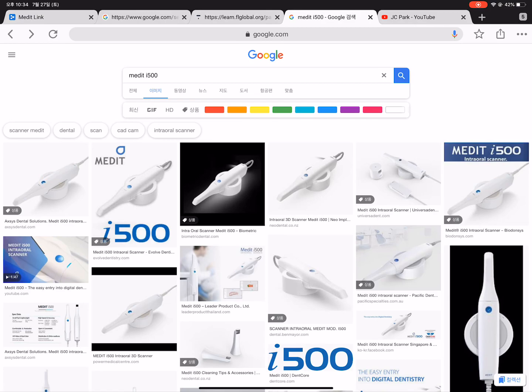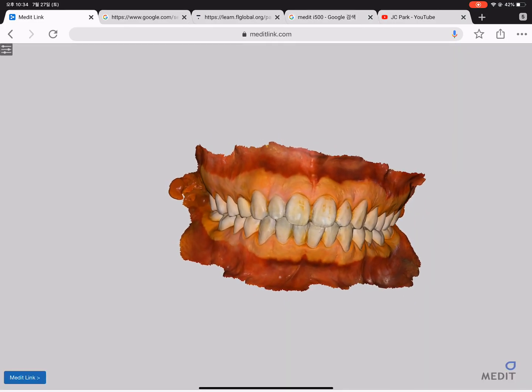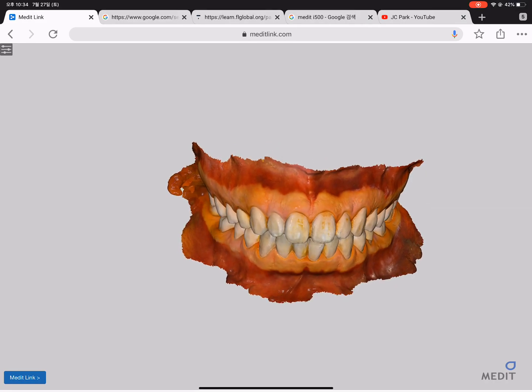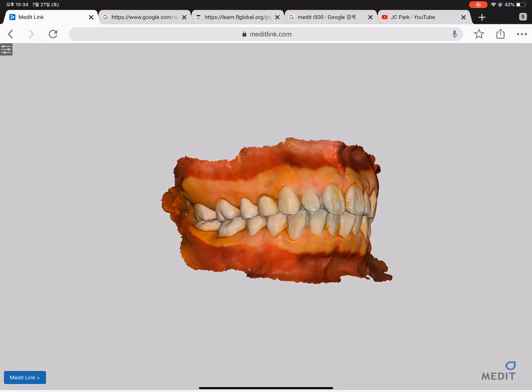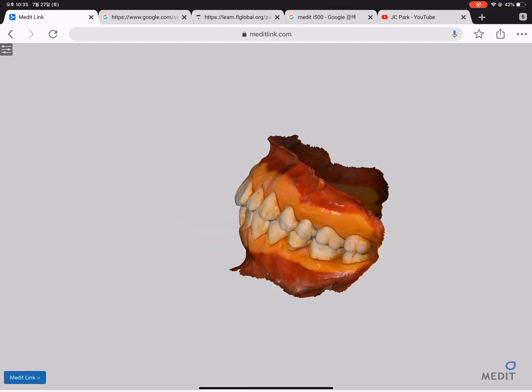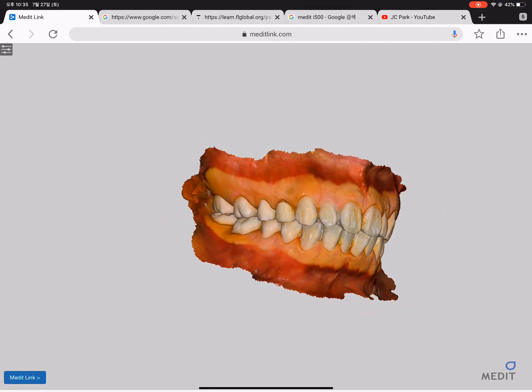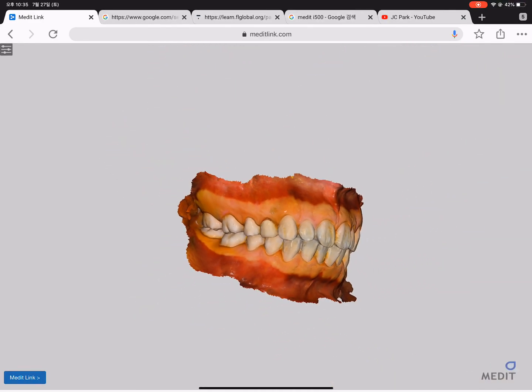You get an external link so that you can view the scan from a web browser. If you click the link, you will see exactly this picture. Without any installation of an application, you can go directly to this link. It is very lightweight and fast, so you can rotate the scanning and zoom in and zoom out. It's easy to share and easy to study after the scanning.